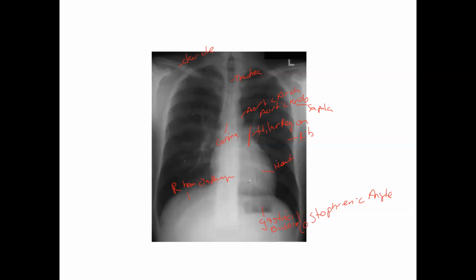And the x-ray should be assessed on those, because I had a patient one time that I was doing tracheal suction on. They had an endotracheal tube, so I was doing inline suction with them, and I started getting back what looked like tube feeds. It was a lot of tan stuff. After checking the x-ray, when they had dropped the NG tube down, that tube had actually slipped past the cuff, went into the trachea and coiled up right there below the tracheal tube. And they turned the tube feeds on. They were filling the lungs full of tube feeds. So you got to be careful with that.